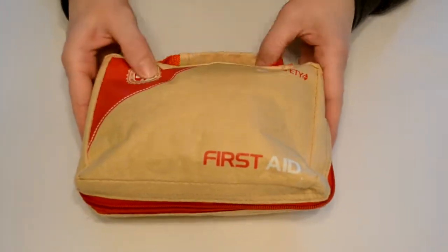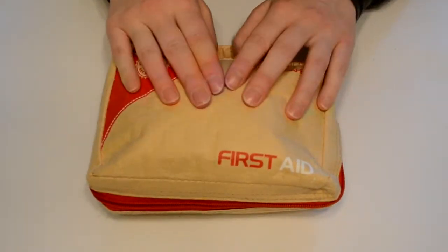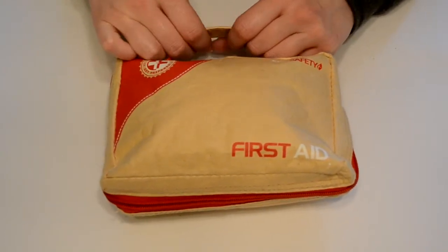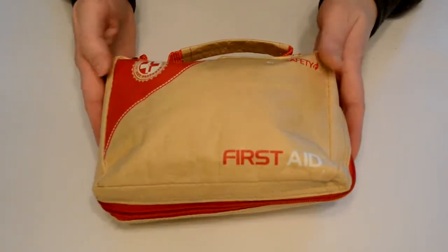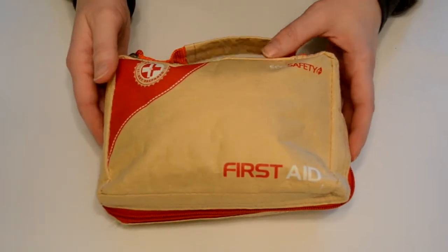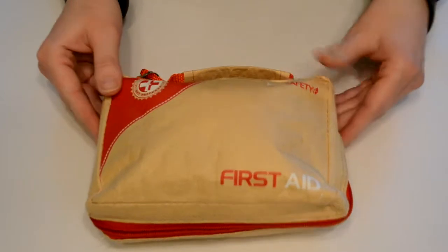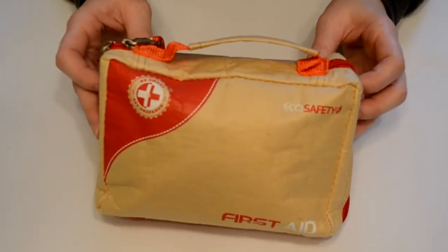But that's it — that's the first aid kit. I hope you enjoyed this unboxing, and it's always a good idea to have some kind of first aid kit with you when you're camping or hiking on the trails. I definitely recommend this eco safety first aid kit. I hope you enjoyed this video, and stay tuned for more unboxings and product reviews in the future.